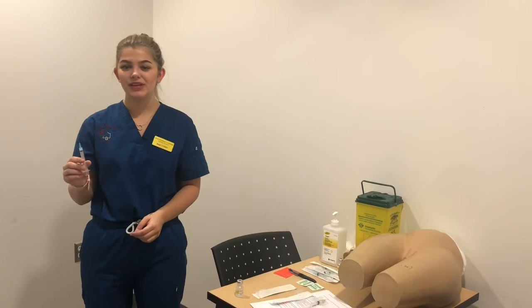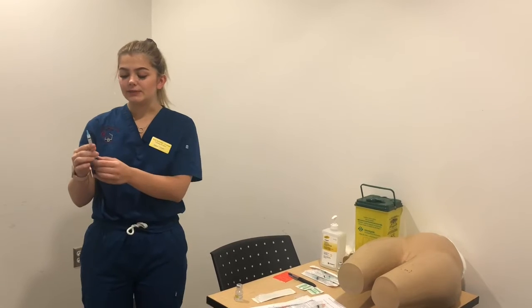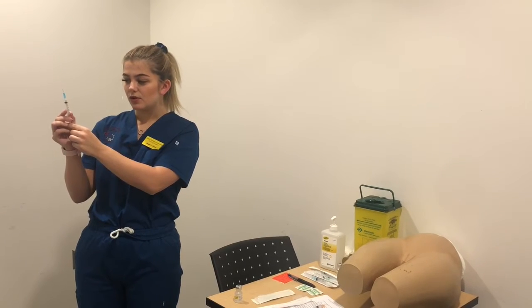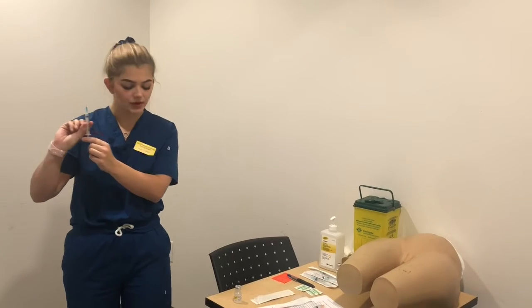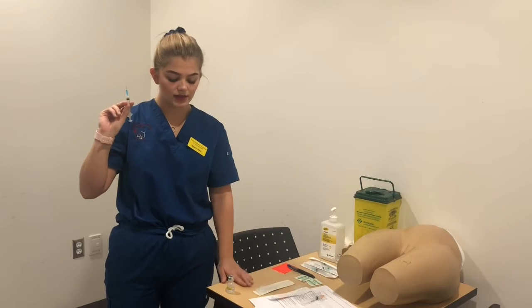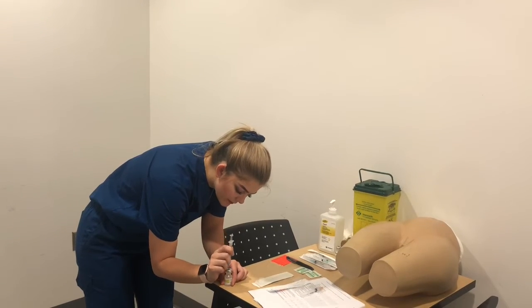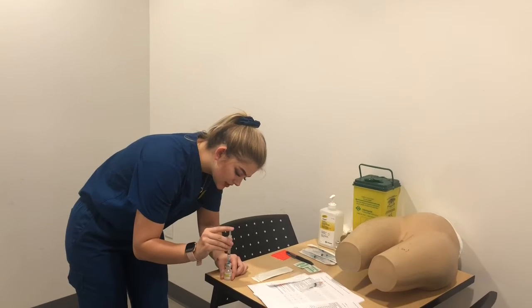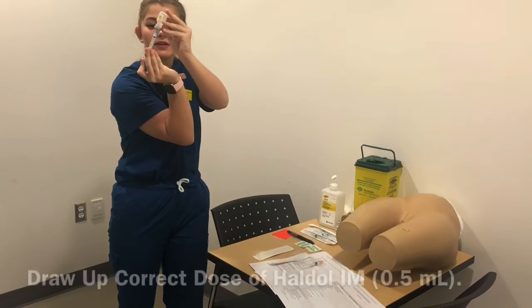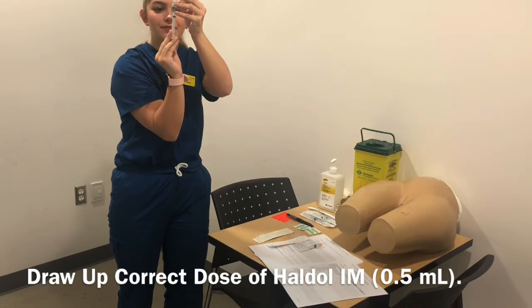Okay, so I will be administering 0.5 milliliters of Haldol. So to do that, I just want to again pull back the air, so 0.5. I'm going to make sure my vial's on the flat surface, hold it, inject it into the vial. Going to insert the air into the vial, tip it upside down, and withdraw the medication.